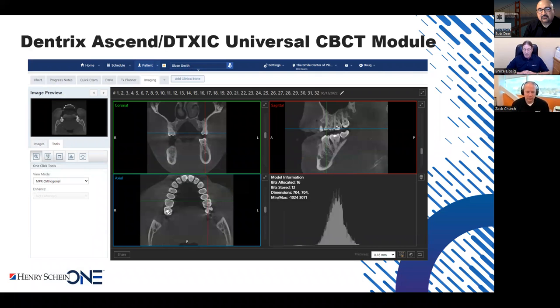I'd like this to be like a reference point when people are researching different software. They can look at this and say, hey, this is Dentrix Ascend and how it differentiates itself from other software. I would hope that they would use this as the benchmark, as the standard of care, and they should go looking for other applications and say, do you do this? Do you do that? Because now we've learned what is the benefit of being embedded? What is the benefit of automation?